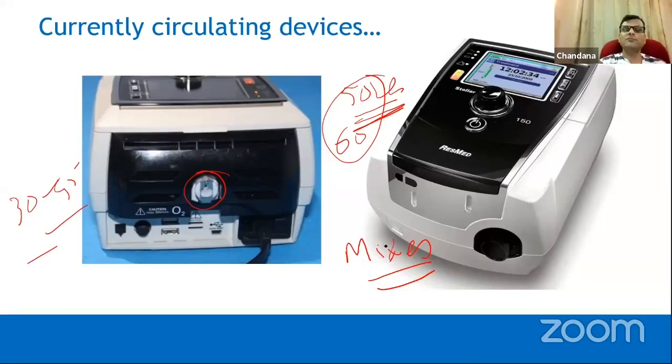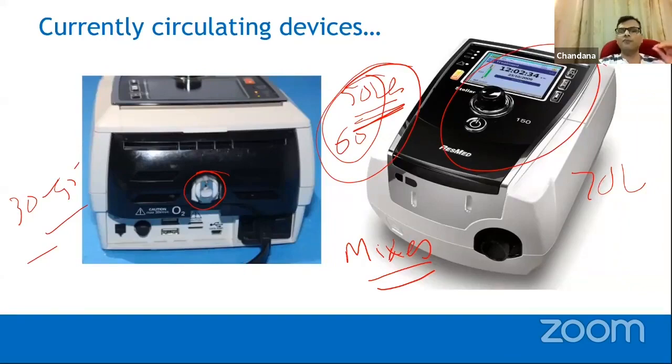Because this turbine mixes air, it will generate the flow. So if the patient tries to breathe 70 liters, it can actually generate even 100 liters, because this turbine is quite capable. It's a very effective, very fast acting turbine. It's extremely comfortable to breathe on, but unfortunately, because it mixes and you have a low flow oxygen attached, you cannot generate high oxygen concentration.